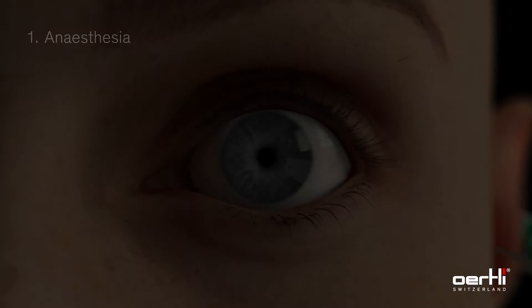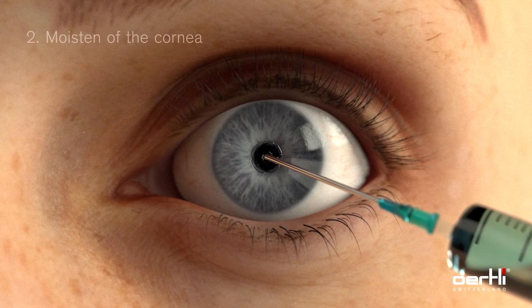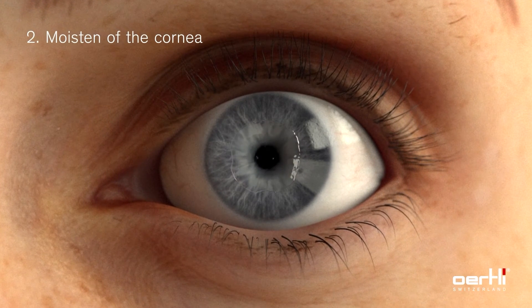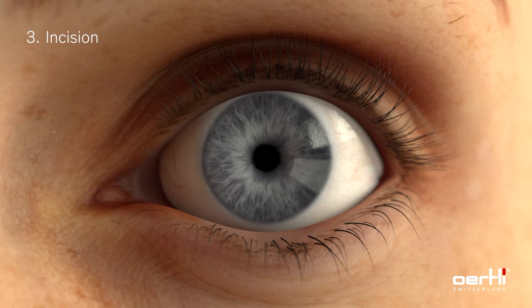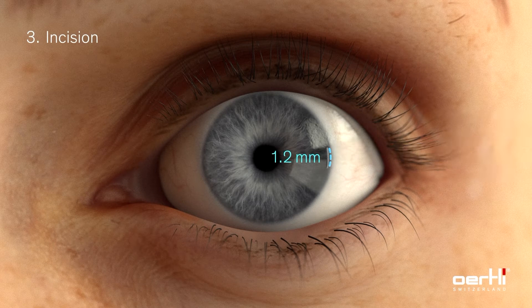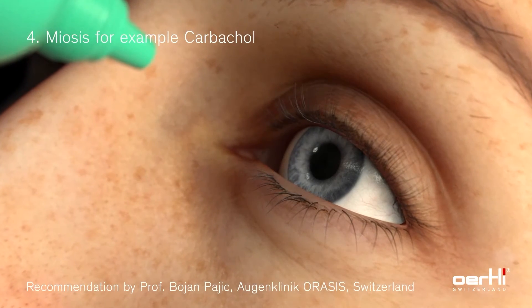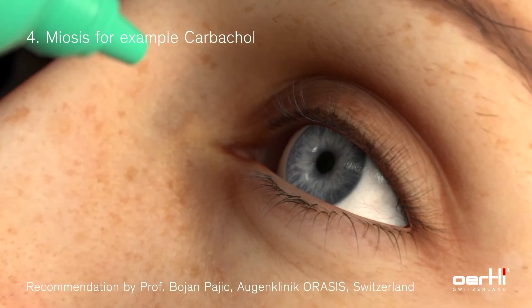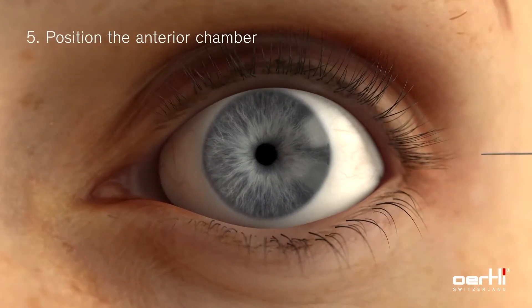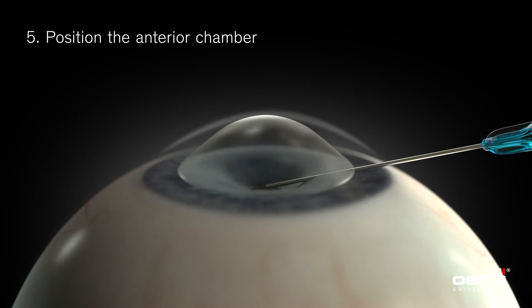The HFDS procedure can be carried out under local anesthesia. Methicel, or viscoelastic substance, is applied on the cornea. Make a temporal incision. It is recommended to narrow the pupil with drops or by intracameral injection, for instance with carbacol. In addition, fill the anterior chamber with a high viscosity viscoelastic substance.